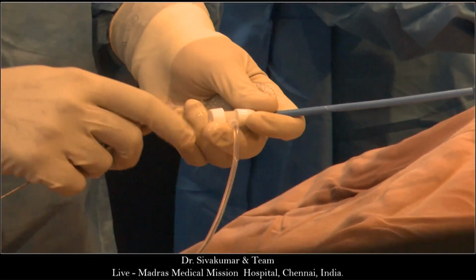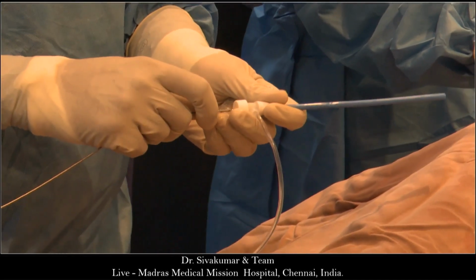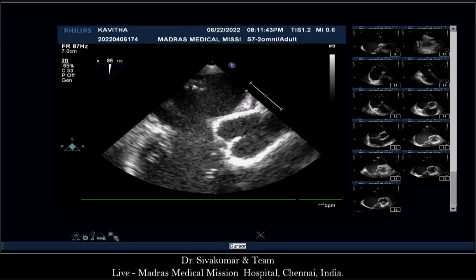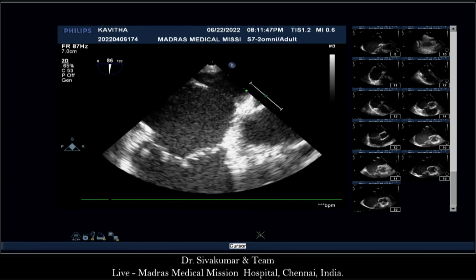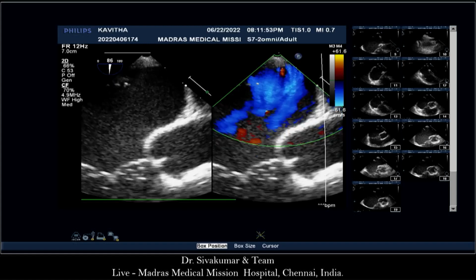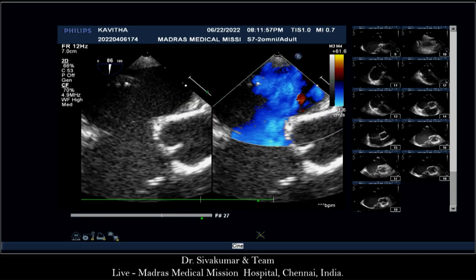What is a bicaval view? Bicaval, yeah, on a left. Show the echo. What's the diameter in bicaval? I'm exposing the ASD only when I'm leftward rotating now. Okay. So that's not bicaval reading. It's 0 on the bicaval. We can measure it, we can't see it. How can we measure it?